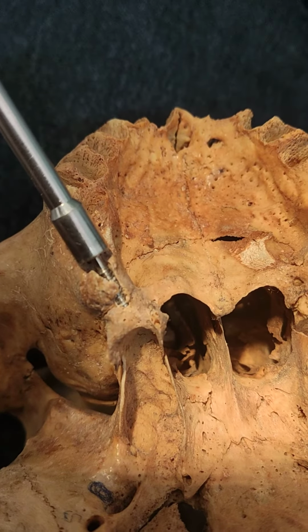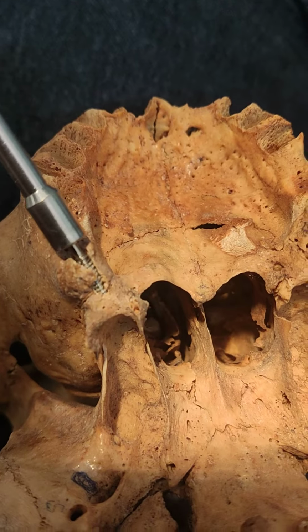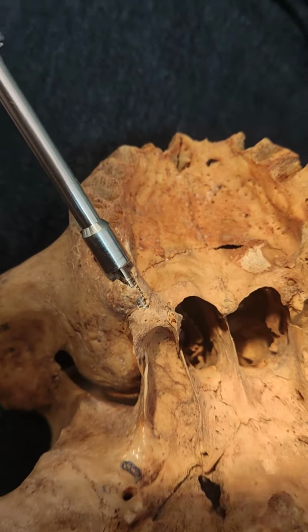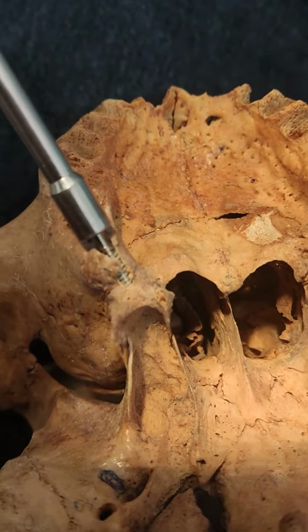the lateral pterygoid. You have to drill for some distance and then feel for the bone, tactile sensation, and then go a little deeper, 2 to 3 mm. Again, you just check for the available bone. Again, you drill. In that way, it's like a blind technique. Placement of pterygoid implant is a blind technique.